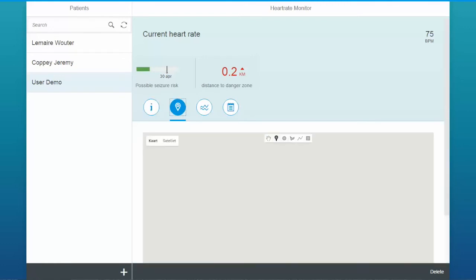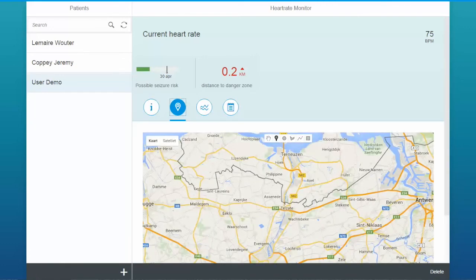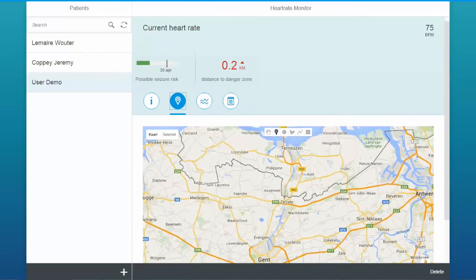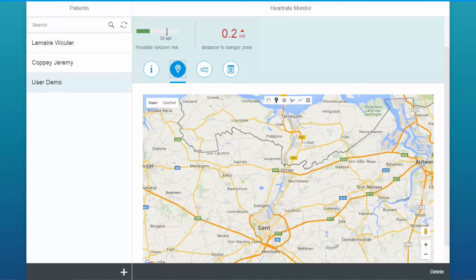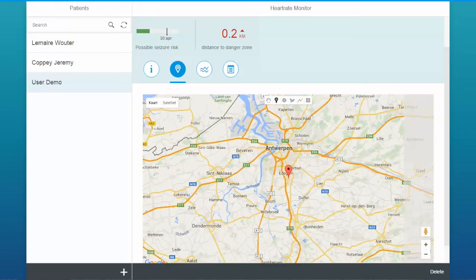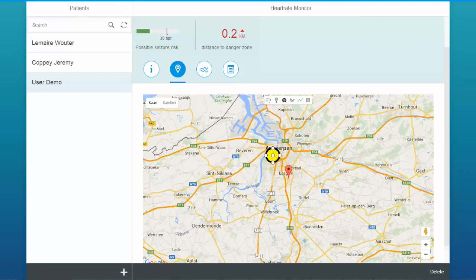On the second tab we have the current location of the patient. On these Google Maps, the doctor can draw danger zones.